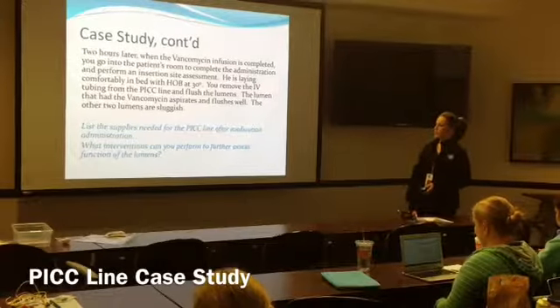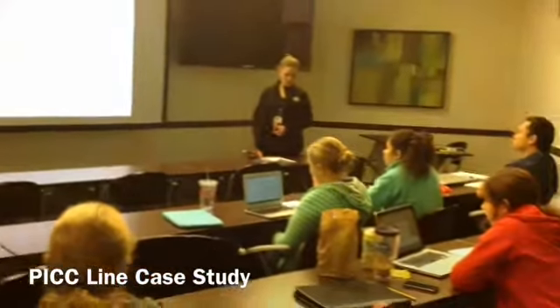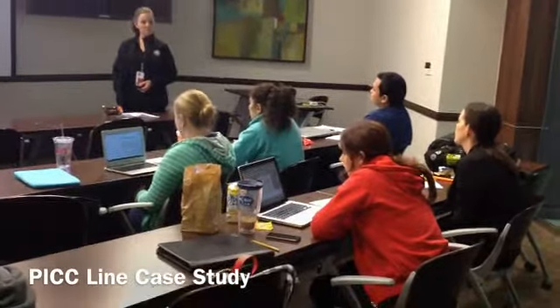So list the supplies needed for the PICC line after medication administration. The flushing. So you may need alcohol.